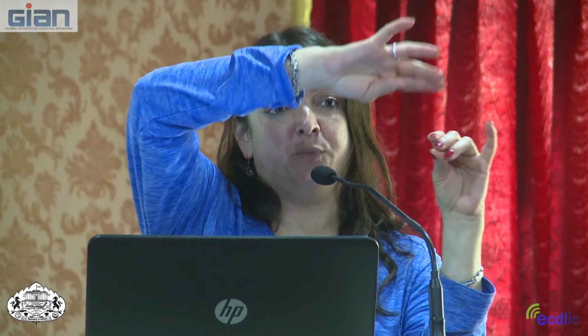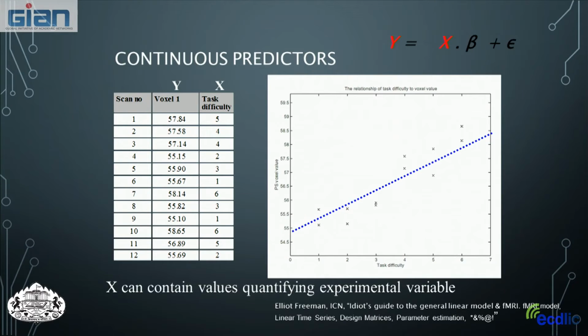So if our task alternates between rest and activity, then we're assuming our data is going to alternate between a certain place at rest and then a certain place while it's active. And we're going to assume this is a linear fit. Yes, the best fit line. So I'm going to show you a little bit more in detail here, and maybe it'll help to understand it.